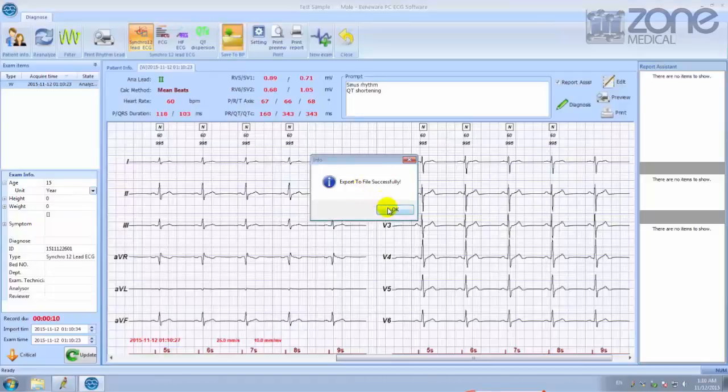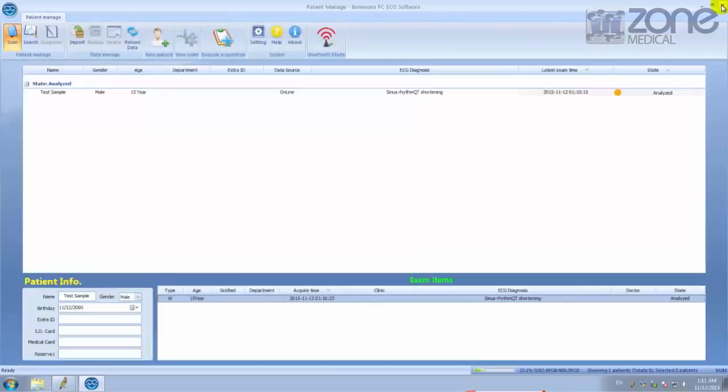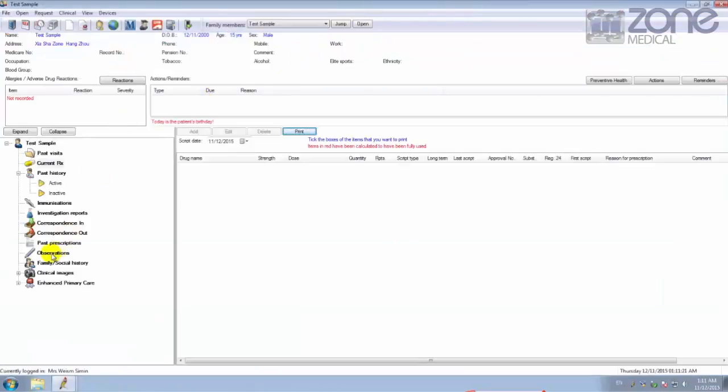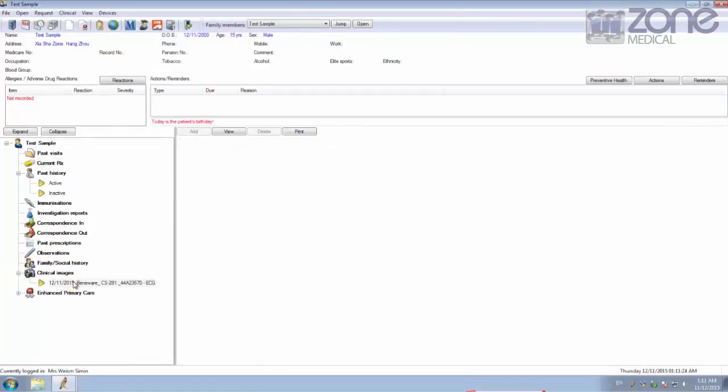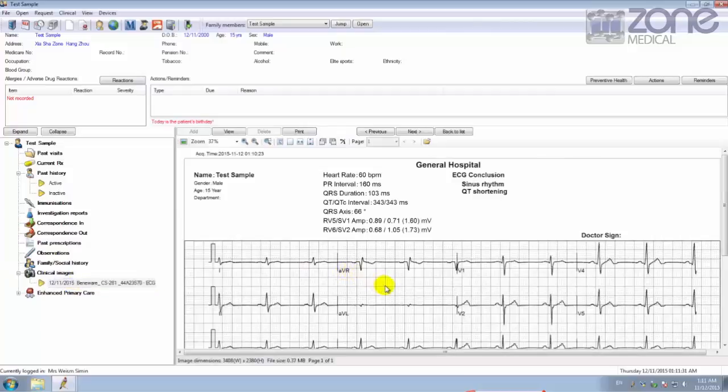From here you can close all the tabs and return to your patient profile. Once you are back in your patient profile, you can click Clinical Images and the results will automatically appear in the patient profile.